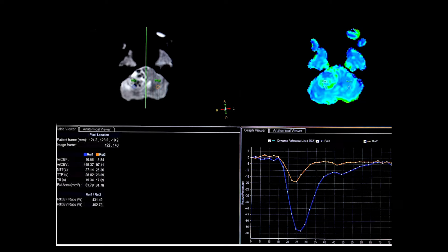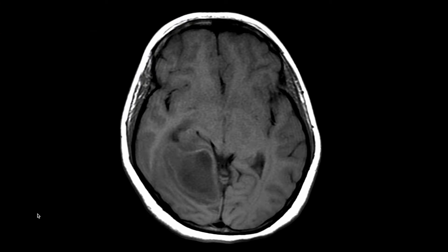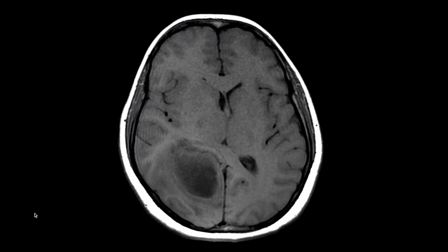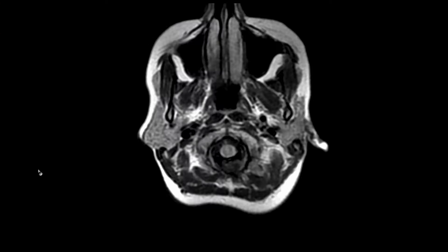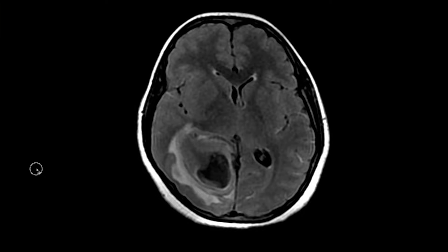Last but not least, perfusion-weighted imaging can help differentiate infectious lesions from neoplastic lesions. In general, infectious lesions will have low regional blood flow and volume compared to neoplastic lesions. In this posterior fossa tumor, you can appreciate high regional cerebral blood flow and volume compared to the control on the left cerebellum.